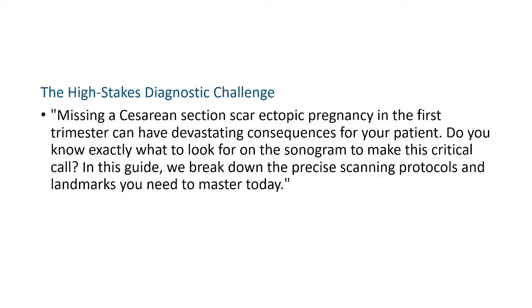So do you know exactly what to look for when you're doing an ultrasound scan to make this critical call? In this guide, we break down the precise scanning protocols and landmarks you need to master before you can say that you're competent in screening for cesarean scar ectopic pregnancies.